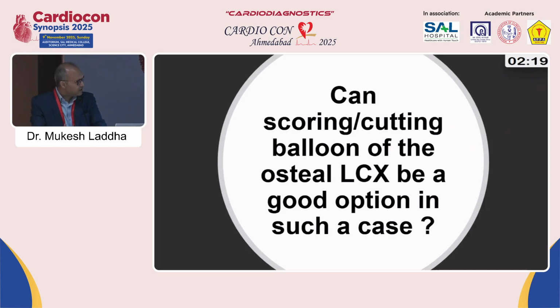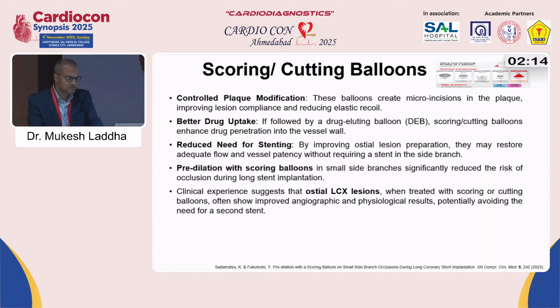Now, coming to the next question: is a scoring balloon or cutting balloon useful in an ostial LCX lesion? We have seen many times isolated ostial disease, and at that time you need not stent from the LMCA to the circumflex. At that time the scoring or cutting balloon is useful. Basically, the cutting balloon creates micro dissection in the plaque, improving lesion compliance and overall reducing elastic recoil. And after a cutting balloon, when you do a DCB, it improves drug uptake and reduces the need of stenting because of better preparation and better blood flow in that vessel.